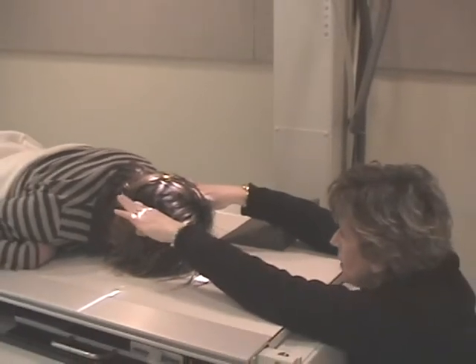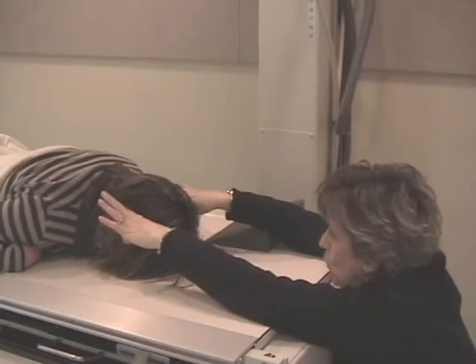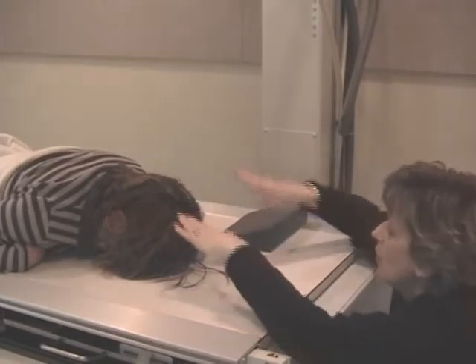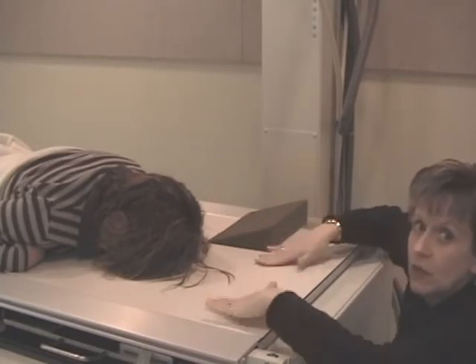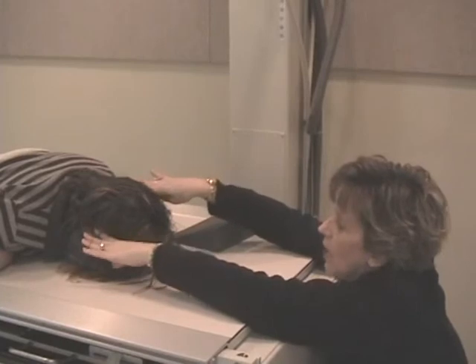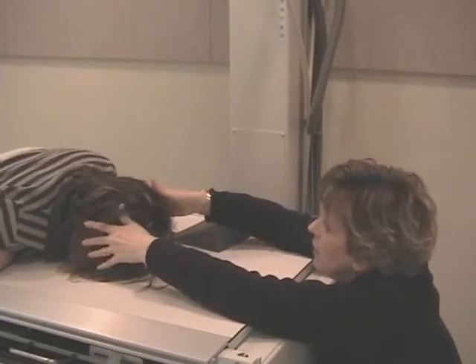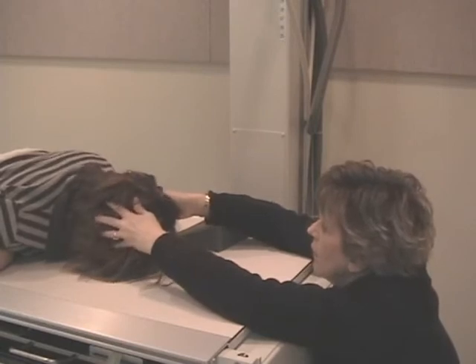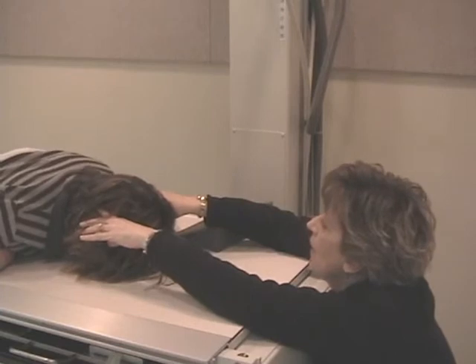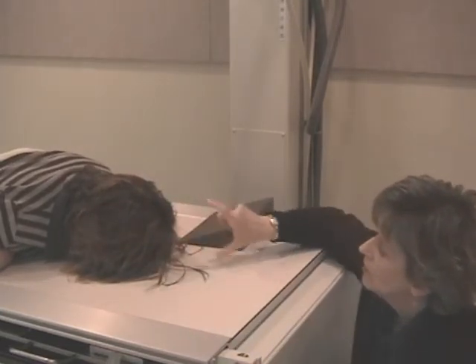And what I'm doing is I'm finding a bony landmark, and I can feel the mastoid tip on both sides, and I'm making sure that they are the same height from the table. In other words, if she was rotated, see how my hands are going to be at different heights? You don't want that. You want to have the skull not rotated, and that means the mastoid tips would be equal distance on both sides.